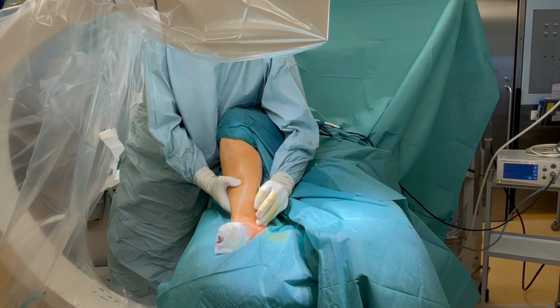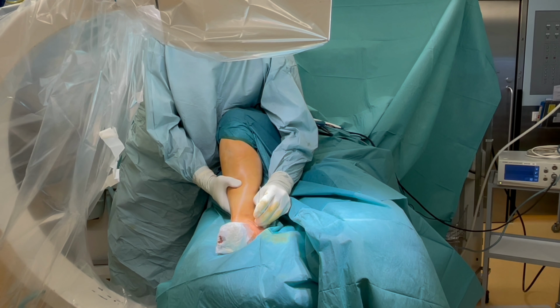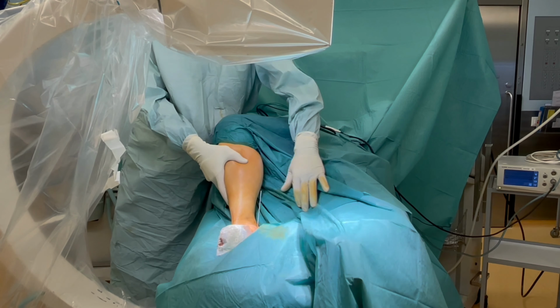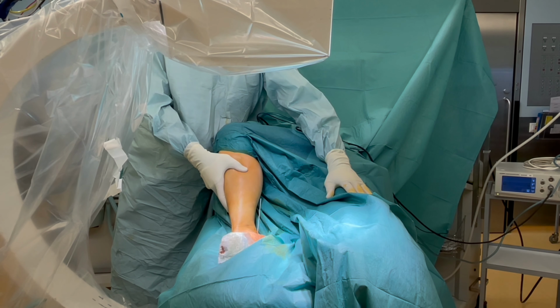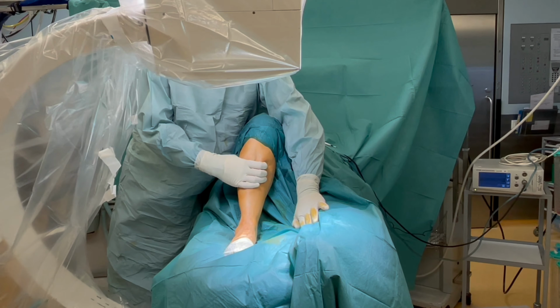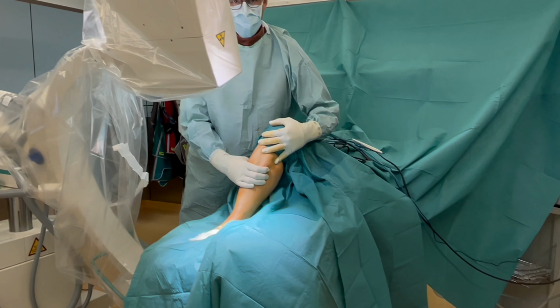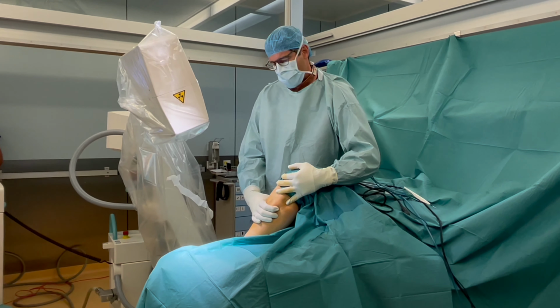During surgery, the medial plantar fascia's calcaneal insertion is located with a K-wire. The K-wire is inserted about 2 centimeters superiorly to the insertion of the plantar fascia until the resistance of the medial wall of the calcaneus is felt. The proper location of the K-wire is verified on the lateral view first. Then the foot is pushed perpendicular onto the OR table, and the dorsoplantar view of the foot is acquired with the X-ray beam 17 degrees posteriorly angulated towards the heel.